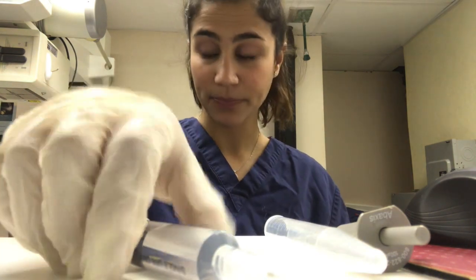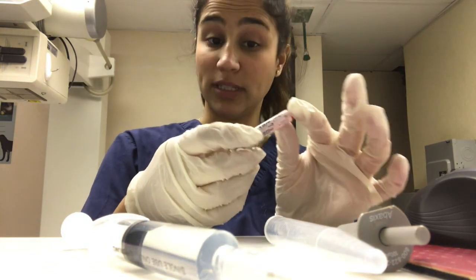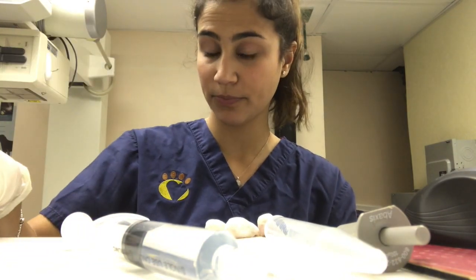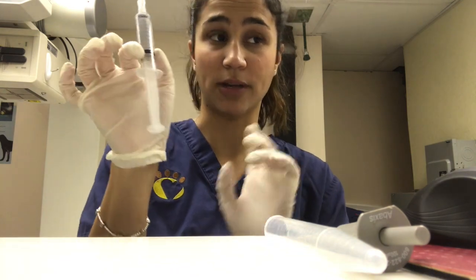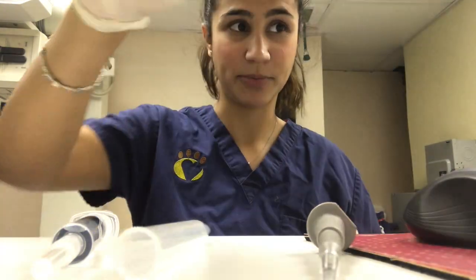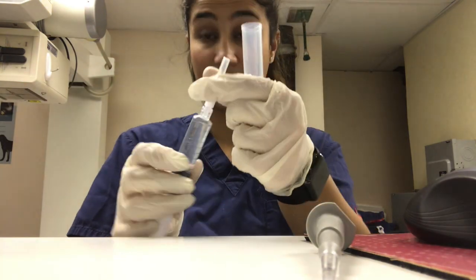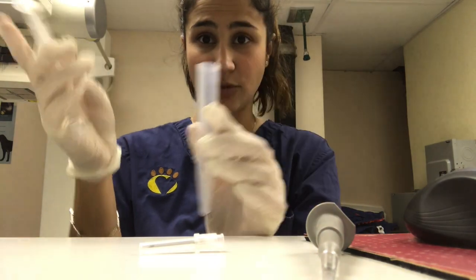So the things that we will need today are 1 ml of anticoagulated blood, which I have here, 9 mL of 2% formalin, our centrifuge tube, and our pipette for our blood. So the first thing I will be doing is adding our formalin, 2%. I'm going to be adding 9 mL into our centrifuge tube.